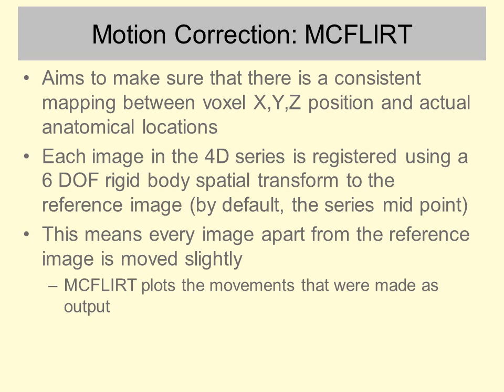Now, there was more detail last week about why motion correction can never be a perfect solution to the problem of the participant moving in the scanner, so do bear that stuff in mind. Also, a quick mention is given here to something called prospective motion correction, which is when you actually have the scanner move the volume around in which it's acquiring the voxels.